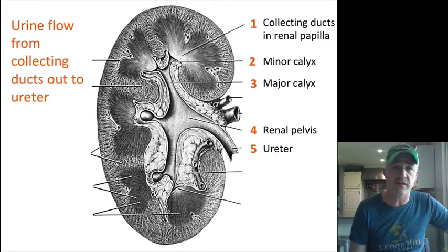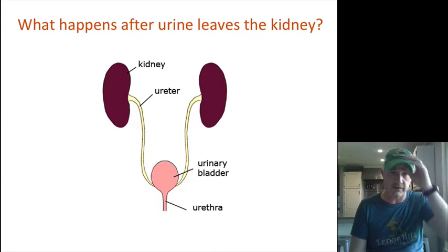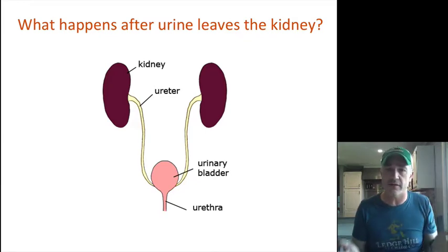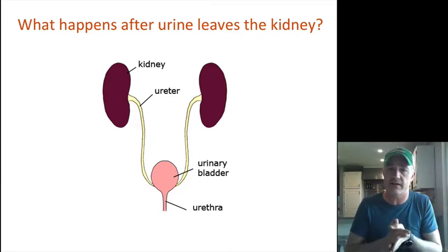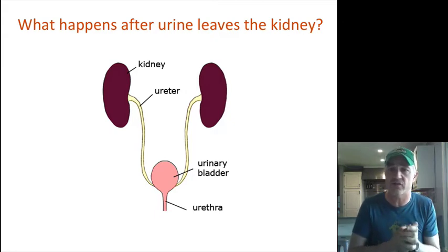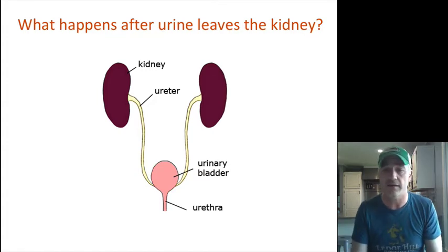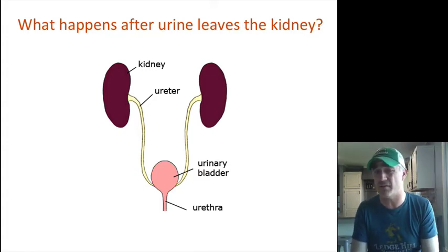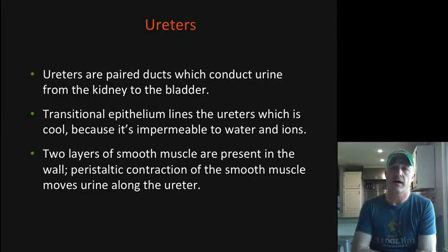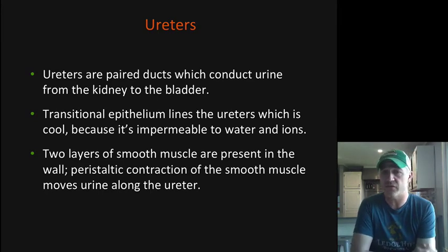That is actually the next thing we're going to be taking a look at under the slides: the ureter. So ureters are the main urine tubes, taking urine which is made in the kidneys down to the temporary storage of the bladder. We have one coming from each kidney. They enter in the lower backside of the bladder, as you can see on this picture right here, again using peristalsis and some smooth muscle to move the urine.